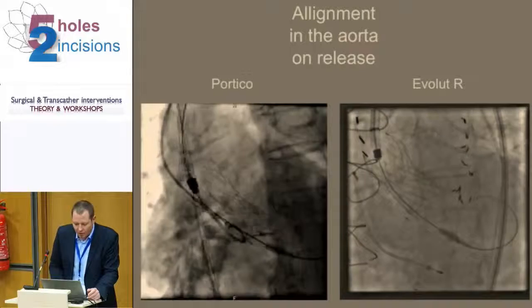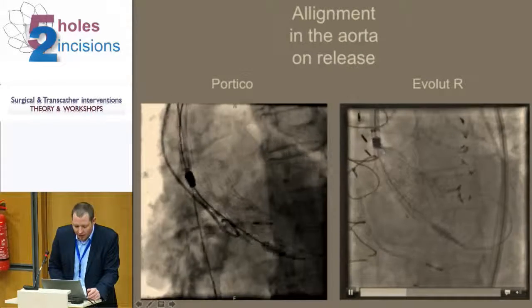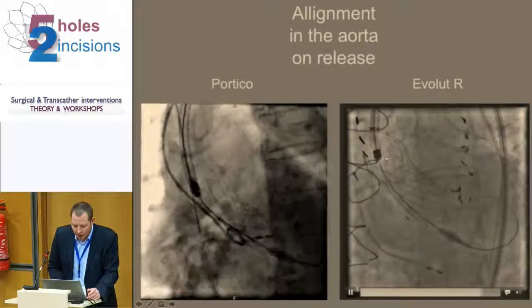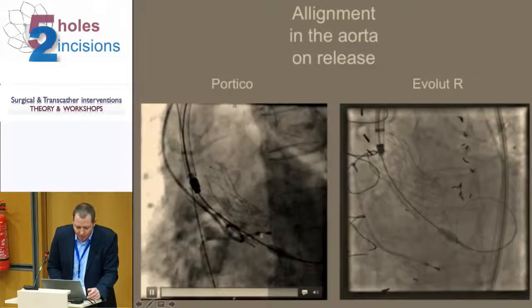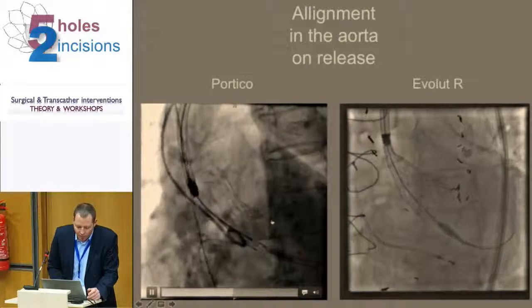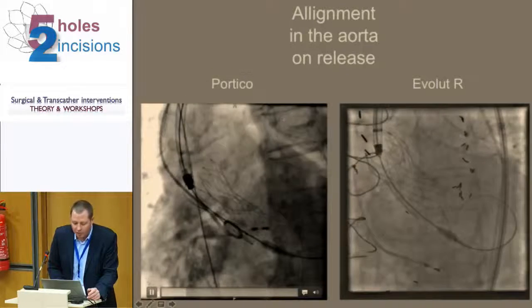So this is what I was talking about. You can see once these devices snap completely open, they will make a kind of adjustment move, so as to then get a balanced position in between the typically borderline low position on the left and the typically borderline high position of the other.